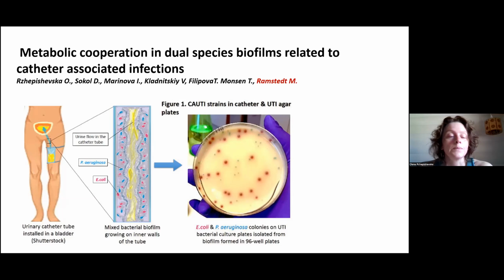This is a person who potentially has some catheterization. So in different clinical conditions, people might have a urinary catheter installed. The picture probably doesn't show all the details of the installation, but this is a less pleasant procedure both for men and women that includes planting the silicone tube up the urinary tract into the bladder.